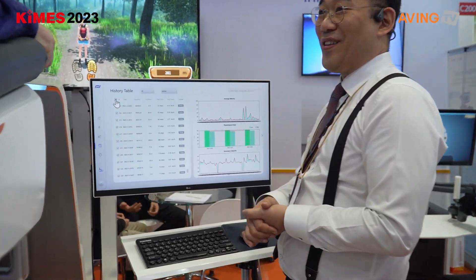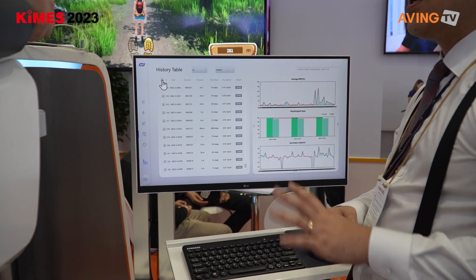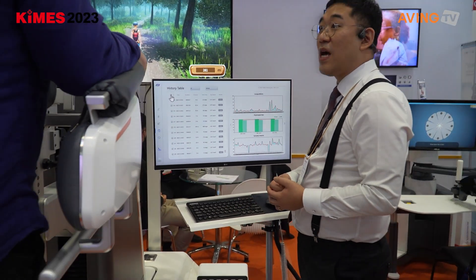There's also a history feature to motivate the patients, so you can see the progress of recovering. You can see how well your progress was yesterday, today, and maybe tomorrow. You can compare everything and have motivation.